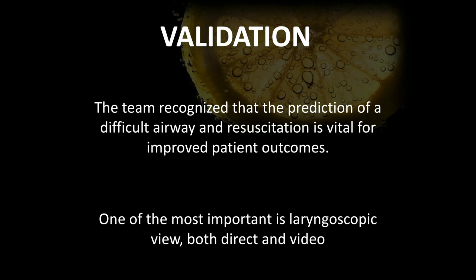The validation side really was the team recognized that really the prediction of difficult airway and resuscitation is vital for improved patient outcomes. And it comes down to understanding the laryngoscope that you're using. As I said, they were using a CMAC laryngoscope. And so it's about the view, it's about really positioning your patients, but really focusing on both direct and video.